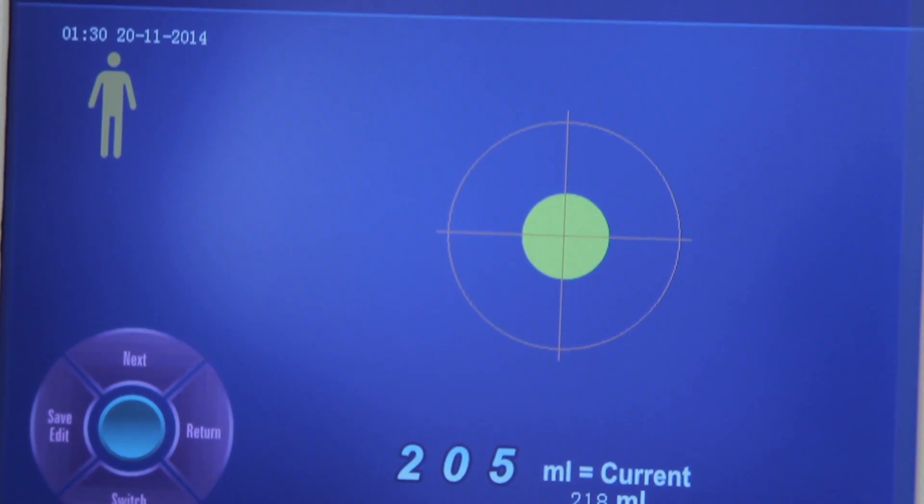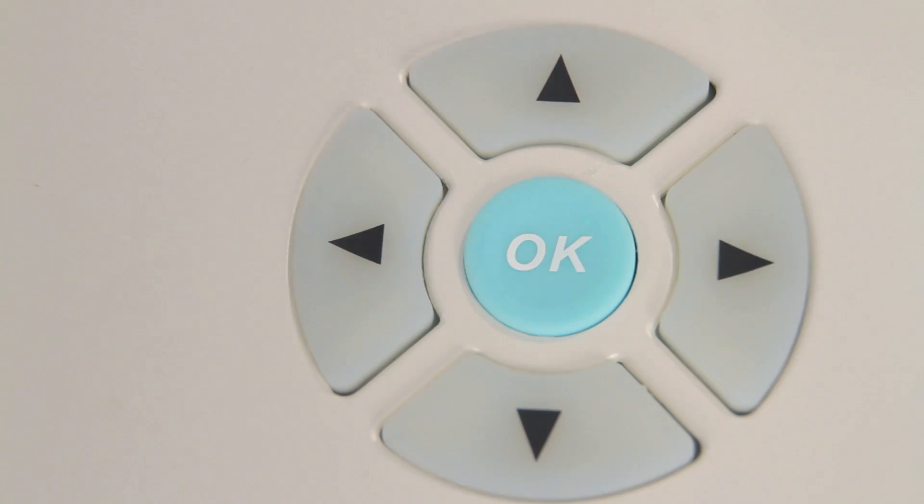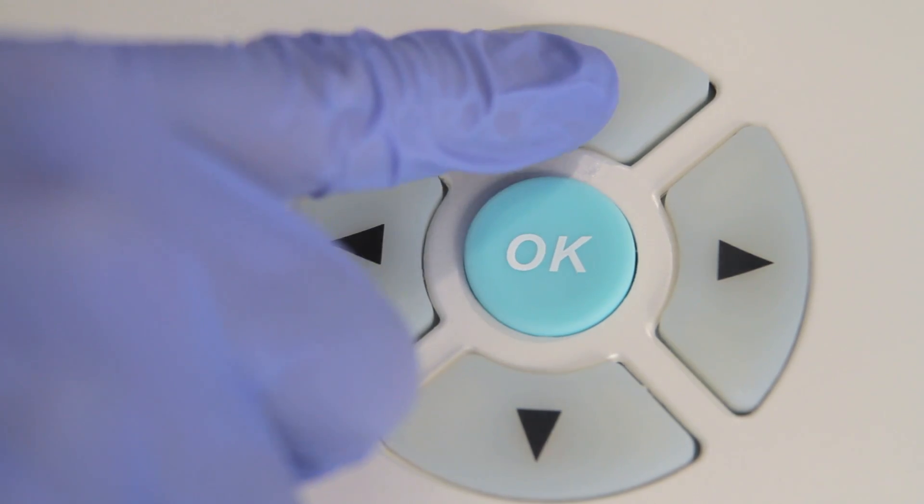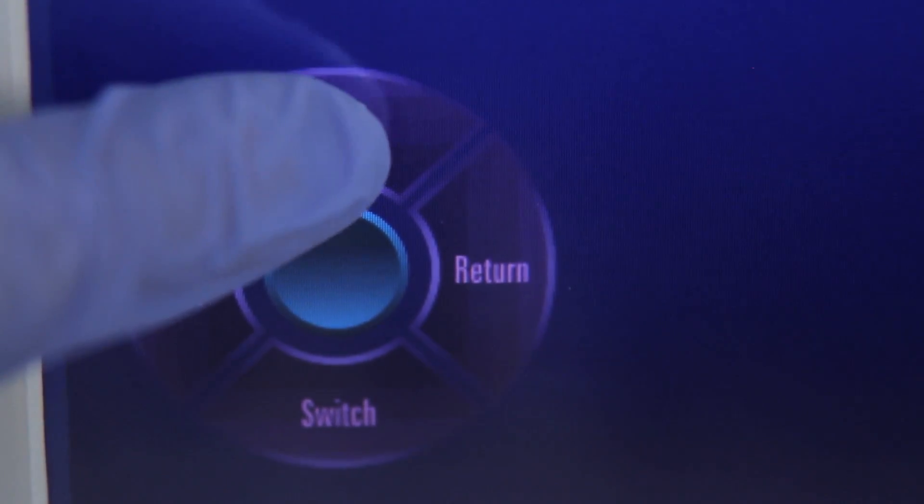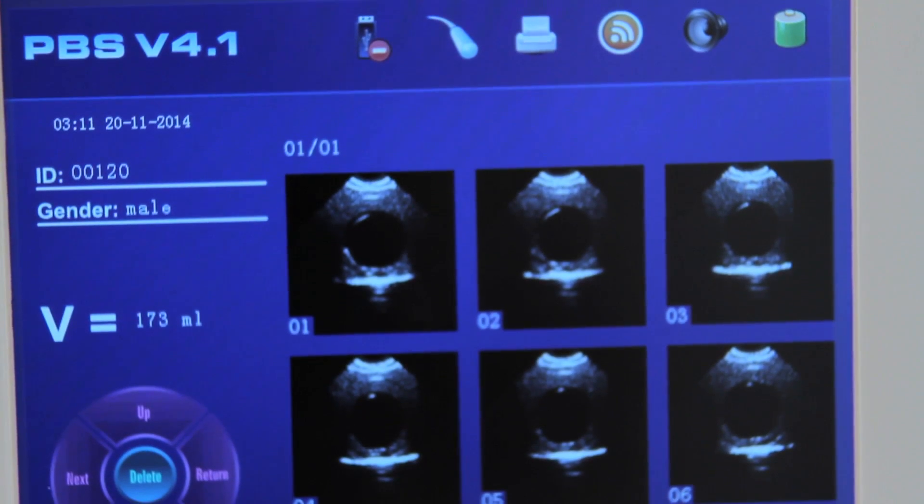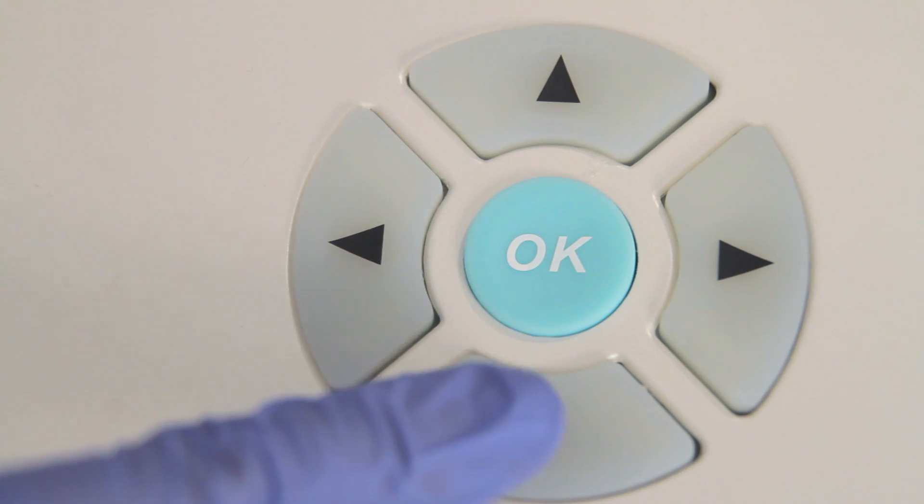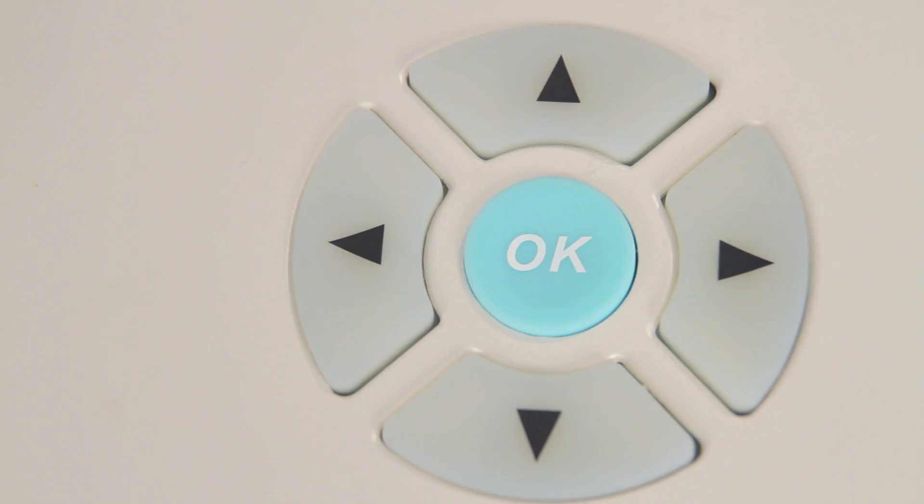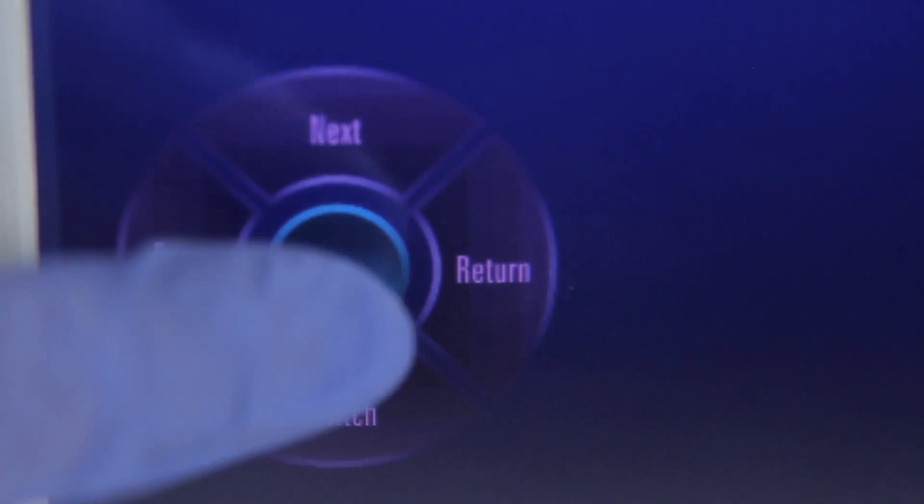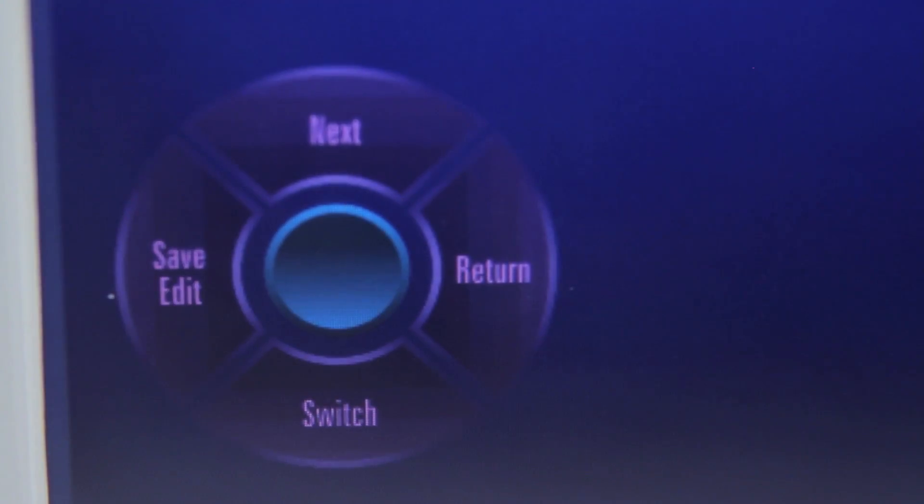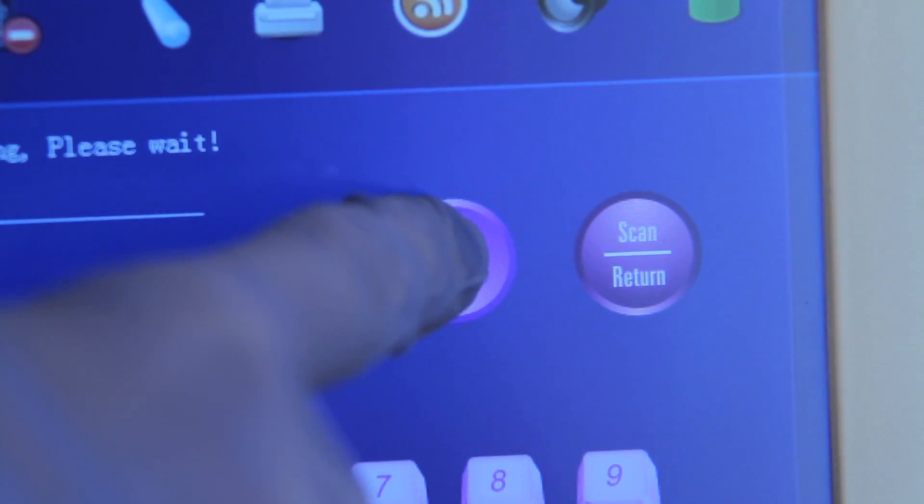The scan results screen displays the results of the scan. Press the up directional key or touch the next functional key to toggle between the scanned images. Press the down directional key or touch the switch functional key to switch between grayscale and two color images. Press the printer key on the control panel to print the current images.